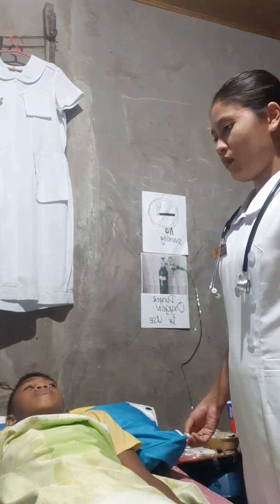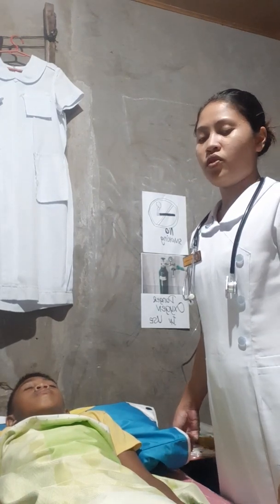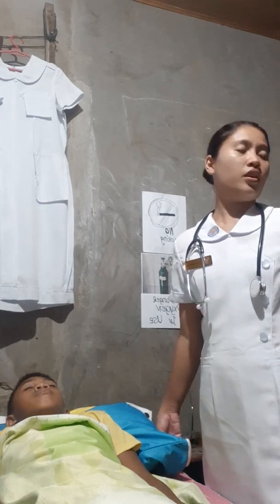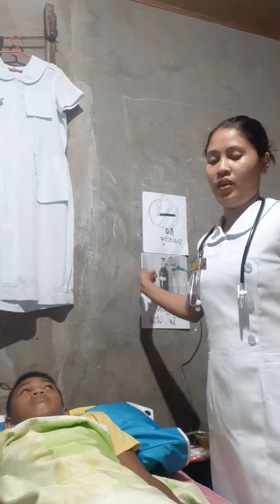So, place the no smoking sign and oxygen use sign at the entrance of the room and also at the head part of the bed of the client.